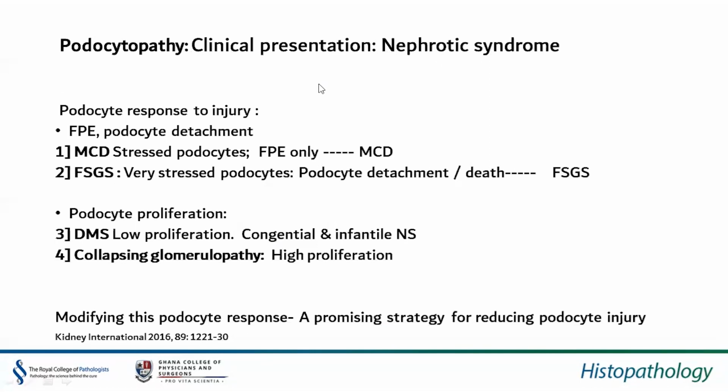Now, podocyte response to injury can be seen in the form of foot process effacement, in which the foot processes retract within the cytoplasm of the podocyte. And in severe injury, there can be detachment of these podocytes from the glomerular basement membrane.